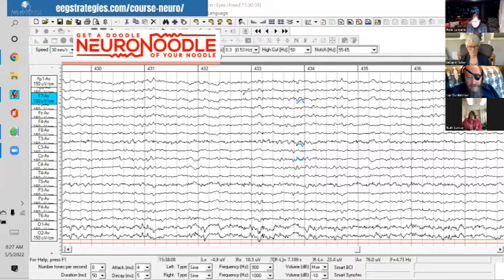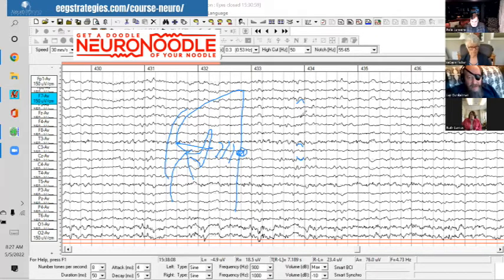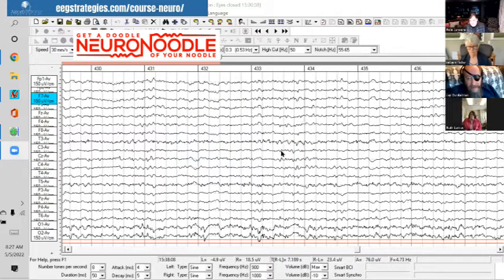When you have the midline of the brain, the frontal lobe, the temporal lobe — the insula is buried deep in. The pyramidal cells here would discharge orienting out, and you pick those up in phase at F7, T7. The butt end of that dipole is picked up at CZ out of phase. When I see the EEG, that's what I see. I'm looking at this going, 'Damn, look at that insula.'